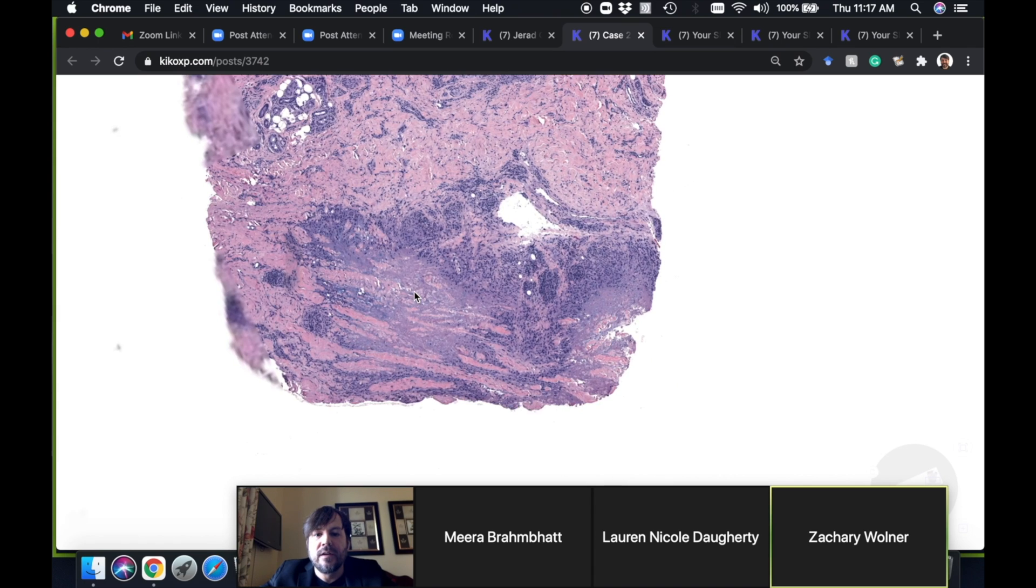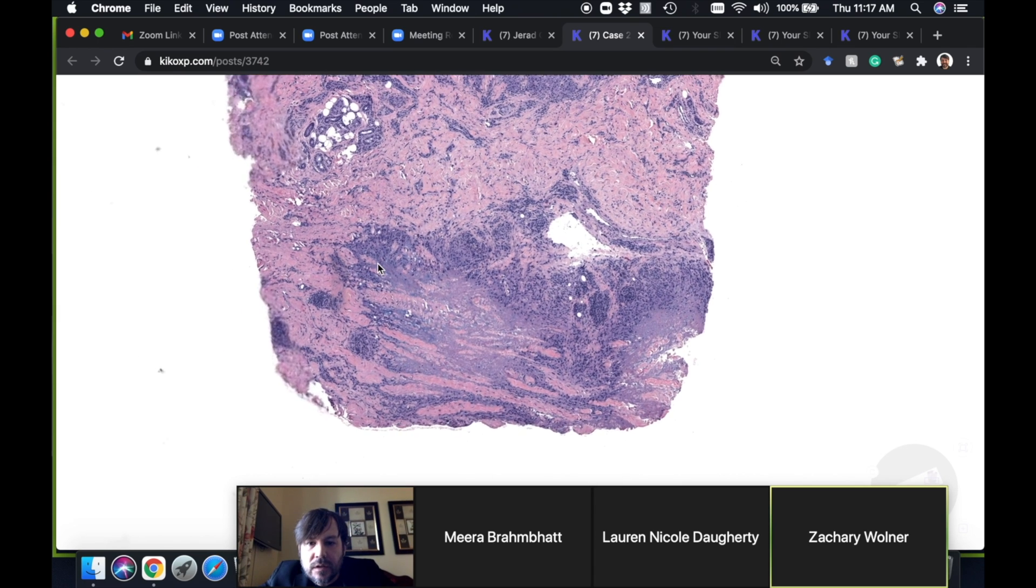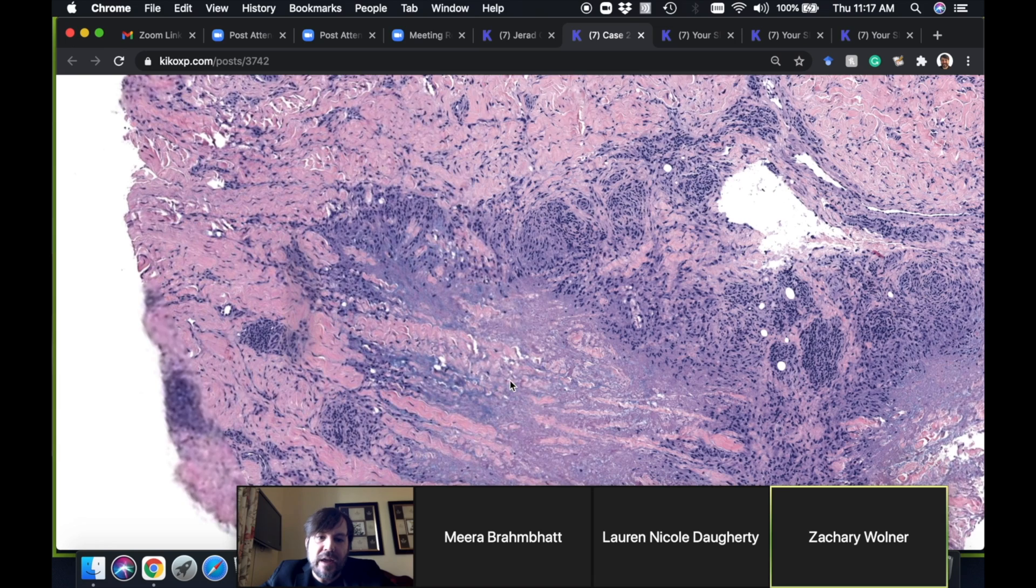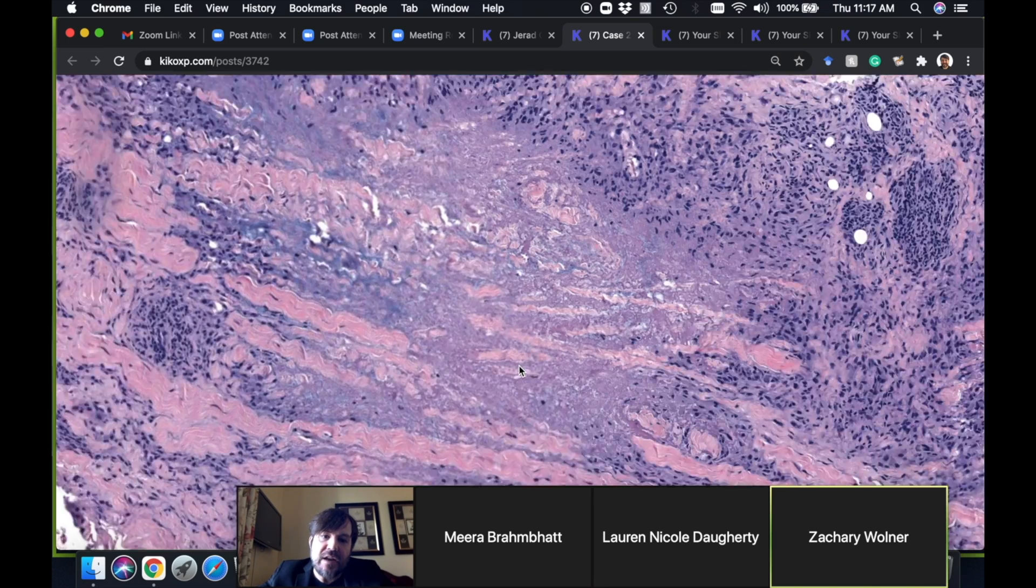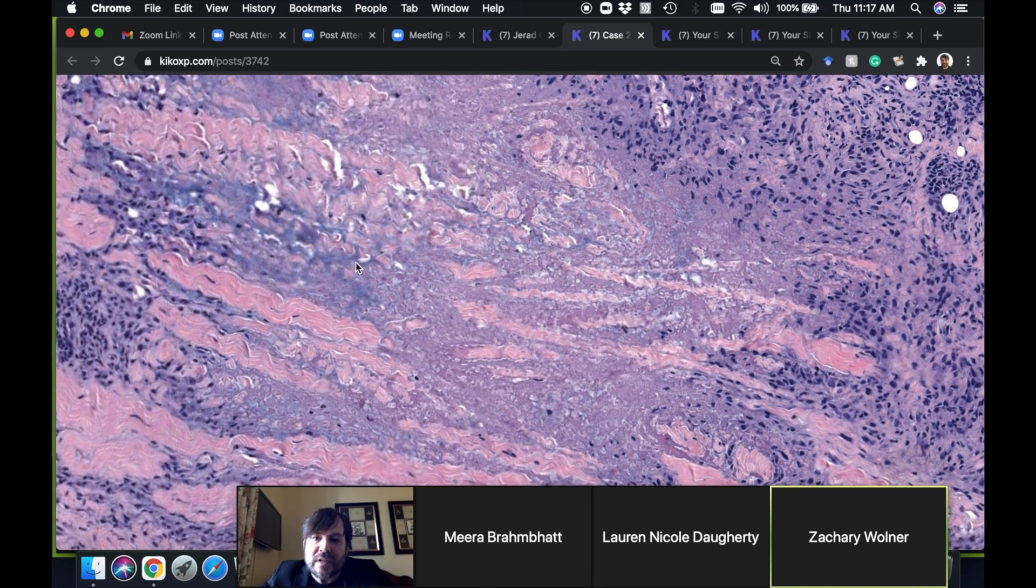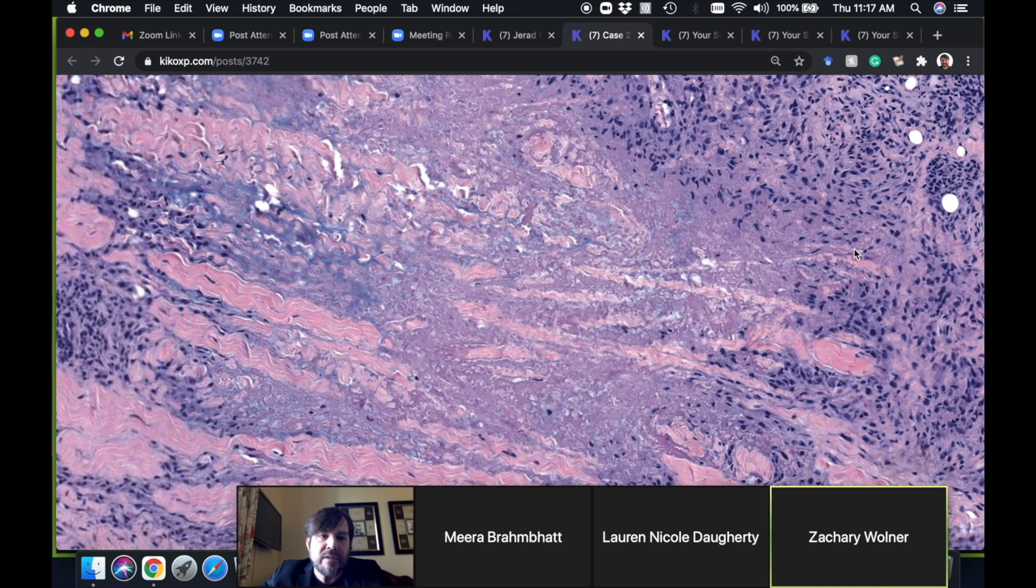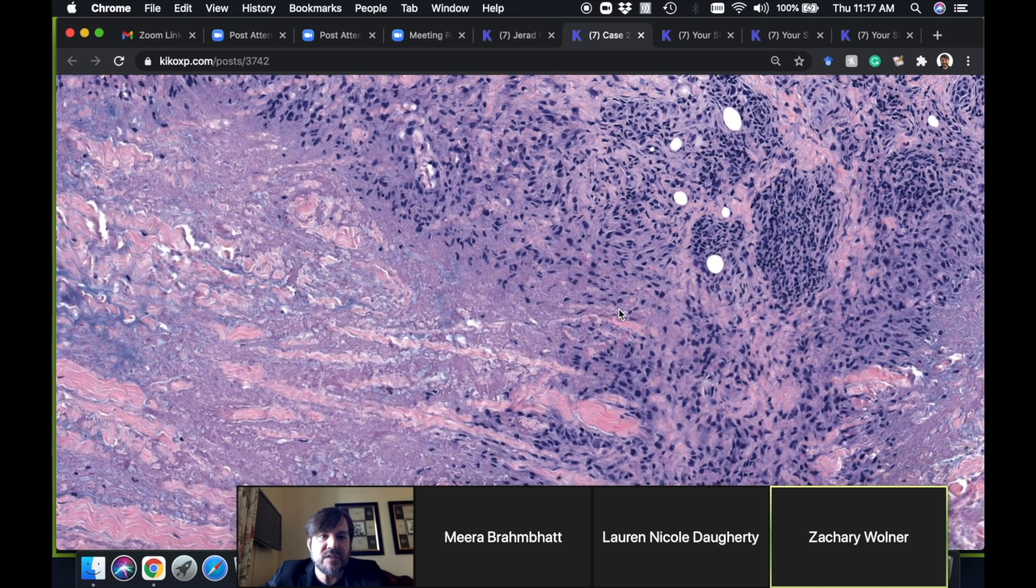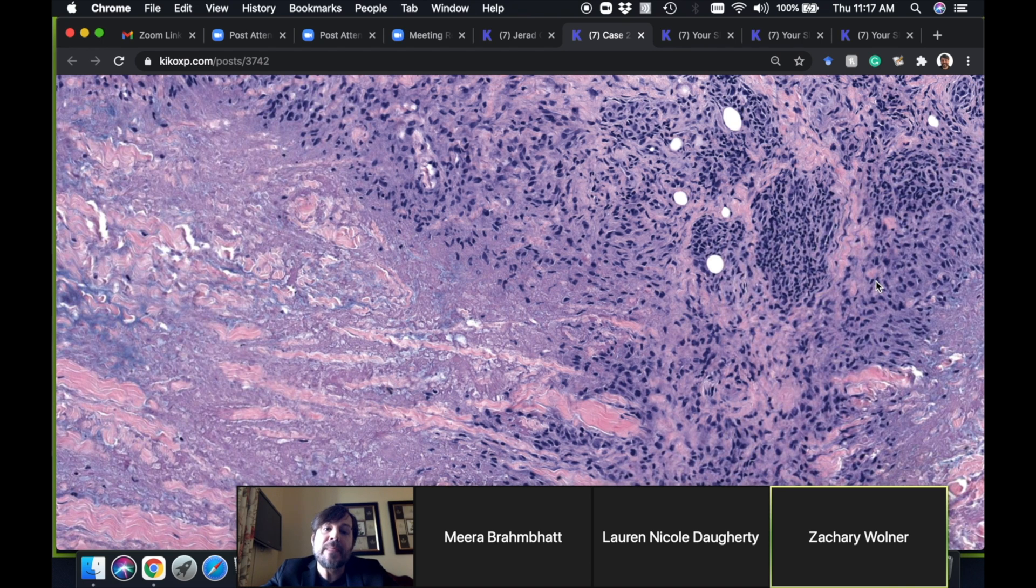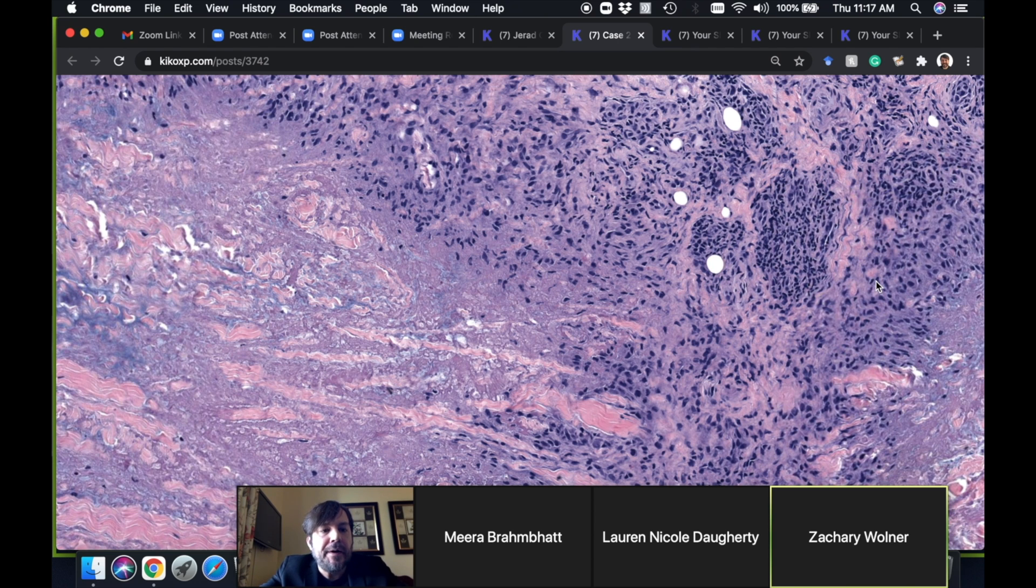Again, you can see really nice necrobiotic collagen, blue mucin in the background, and the histiocytes around the edge. That's granuloma annulare. Sometimes there's inflammatory response with it; sometimes you can see scattered eosinophils, that's a relatively common finding.